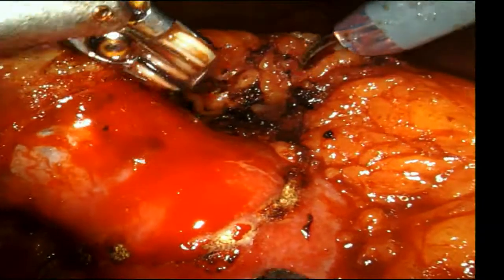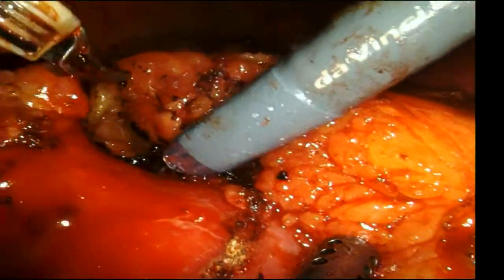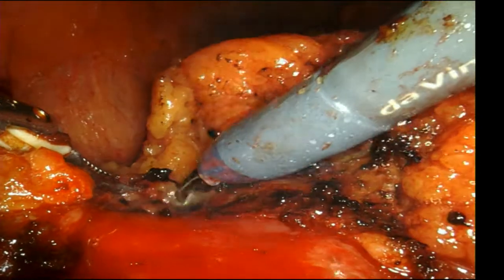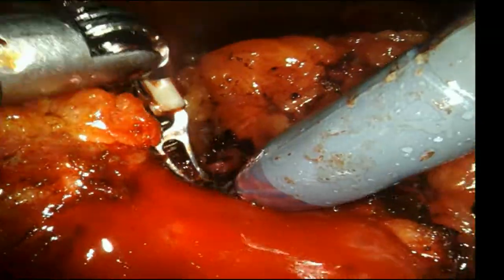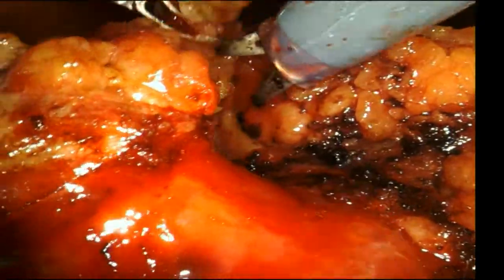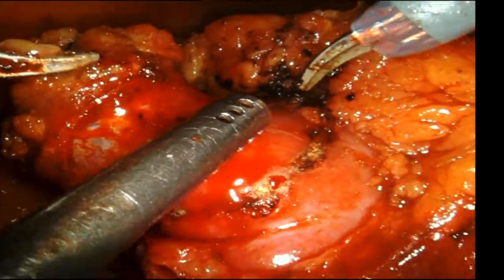So what we found is on the Si robot, a half a cc was the ideal dose in the vast majority of patients, about 90% of the time. On the Xi robot, the dose has to be less because the Firefly is stronger. We usually use a quarter of a cc, but this guy's kind of small, so I don't want to overdose it. So I'm going to start with 0.2 or a fifth of a cc, and then if that's not enough, we can always go up.